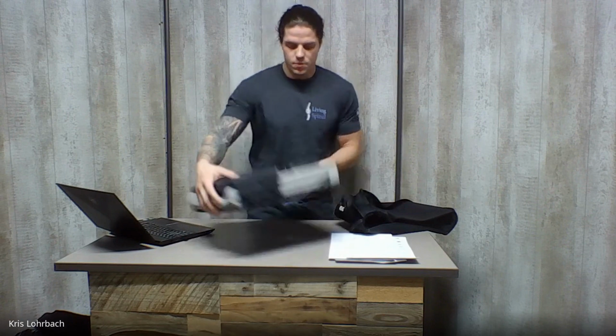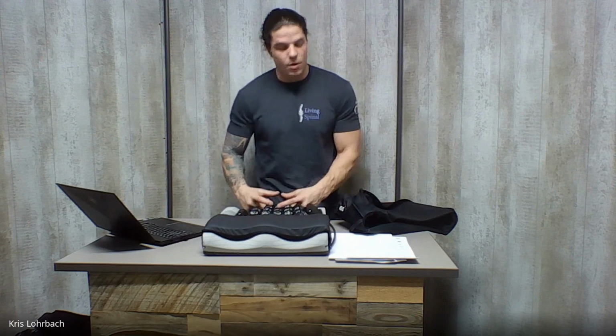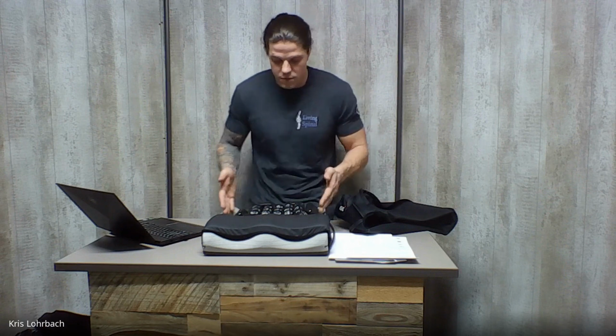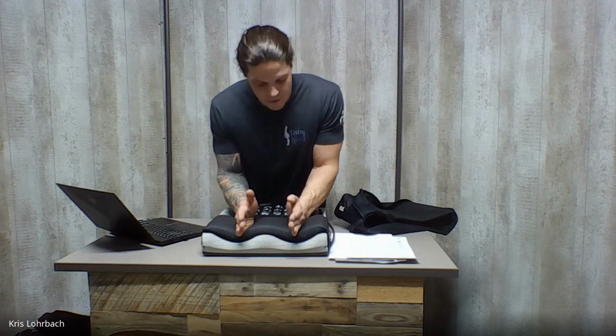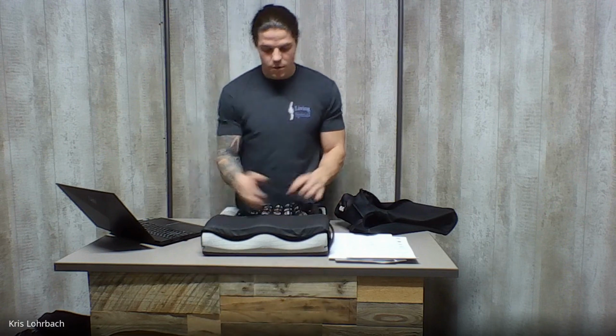This would be where you'd sit. The rear end would be here, and your legs would come up front here. So this is that coccyx relief pad. This is kind of a larger example. Sometimes they're as small as that, where it gives you that great pressure distribution in an area where somebody is likely to get sores. But it also gives you really good posturing here along your femurs. And then it gives you a nice gel pad in the front, so your legs can sit in it really nicely. And if people have alignment issues where one leg kicks off or something, it aligns it really nicely out towards the front. So here's a great example of a cushion that does a lot, but is also accessible to a lot of different kinds of people.